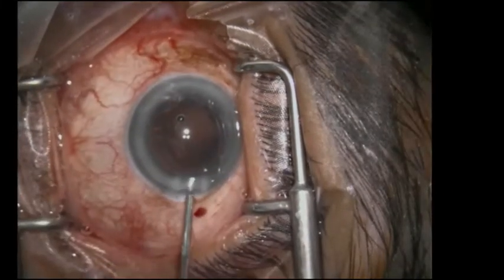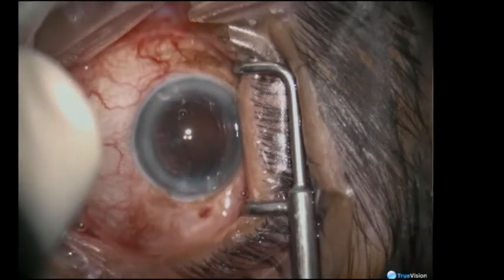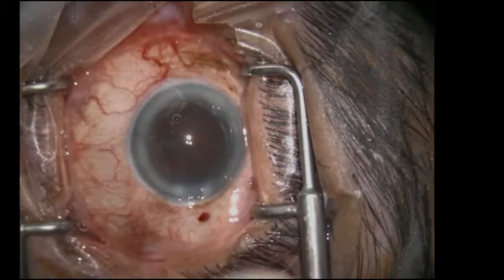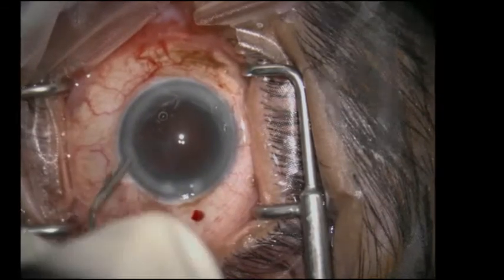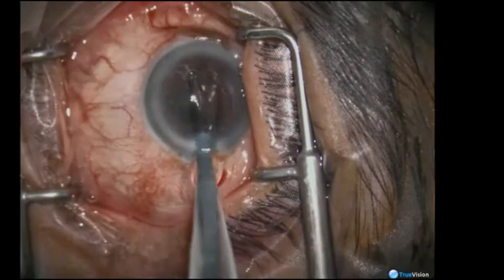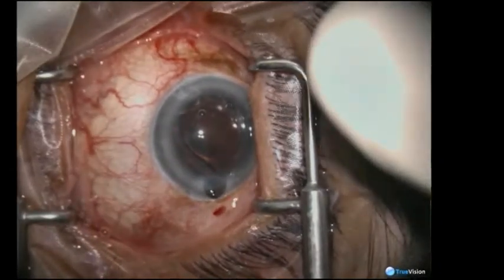The viscoelastic was injected. You can see the visco being ejected out because of raised pressure. The anterior chamber was re-deepened in a guarded way, taking care that there was no prolapse of iris. The intraocular lens was then somehow implanted into the anterior chamber. The iris at this stage started to prolapse from the main port.